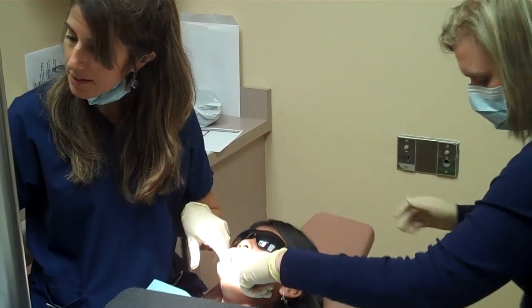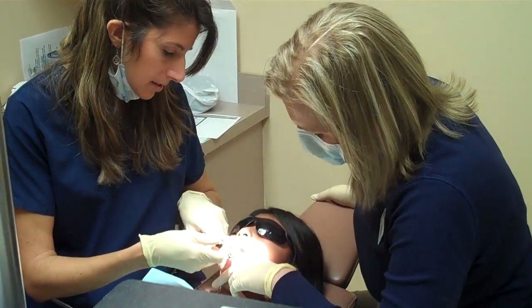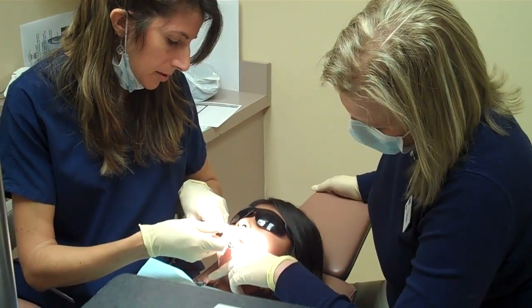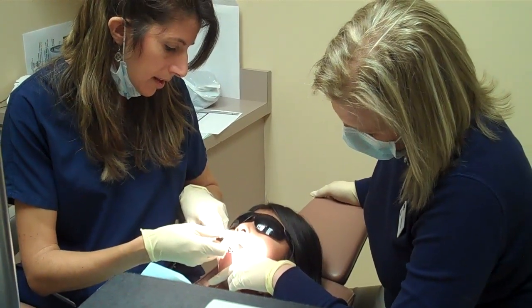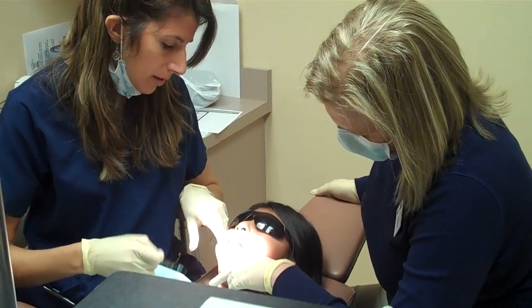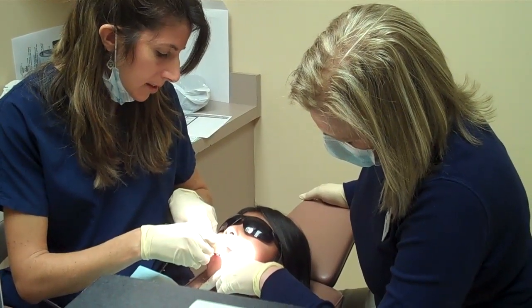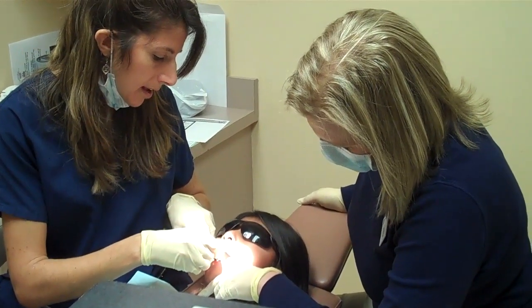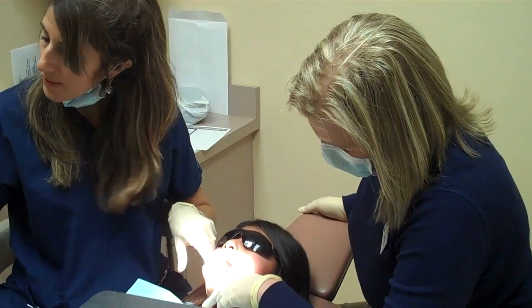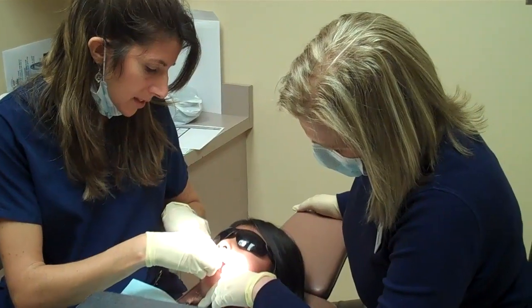And then we just paint on the sealant into all the grooves. Typically we seal all the molars as they come in. And then if the child has really deep grooves on the tooth in front of the molars, the bicuspids, we will suggest to the parents that they seal those teeth also. And even in adults, if they don't have cavities and they have a deep groove that's getting a little suspicious looking, sometimes we can even seal the adult teeth.